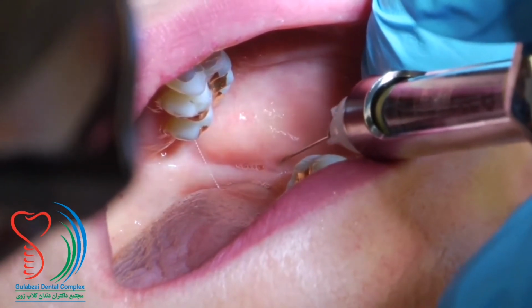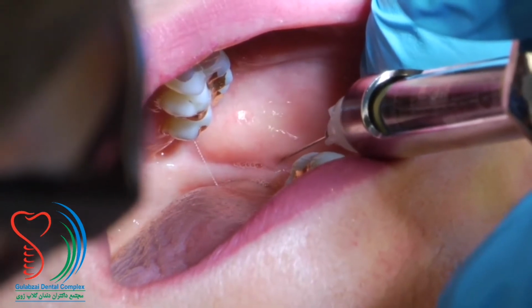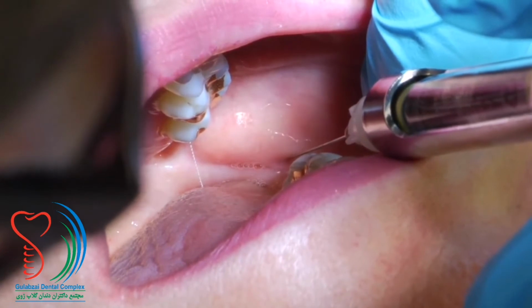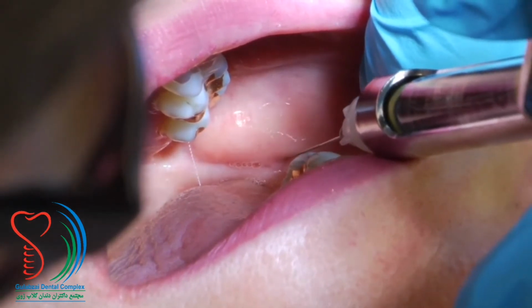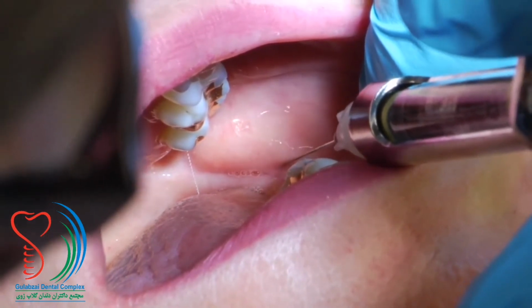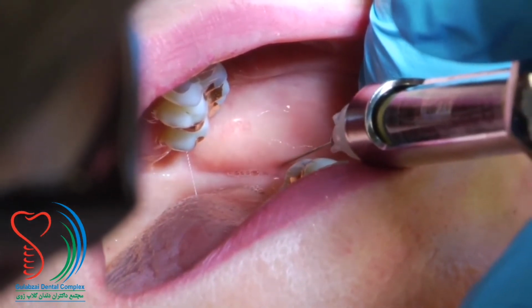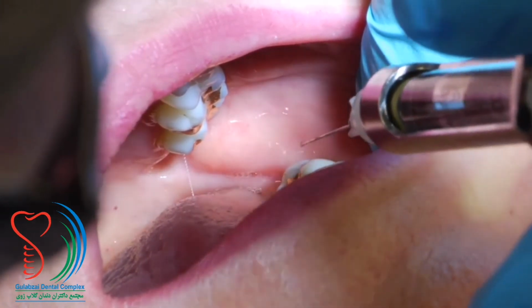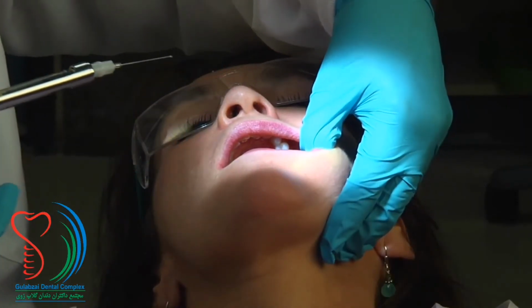This is a very shallow injection, and you'll meet resistance quickly. After a negative aspiration, another 1/8 of a cartridge of anesthetic is deposited here, and that should complete the full carpule that you started with, so you have used the entire cartridge to give these 3 block injections for the mandibular quadrant.